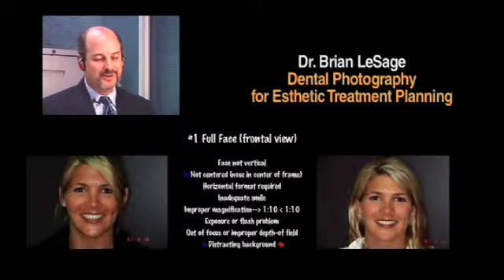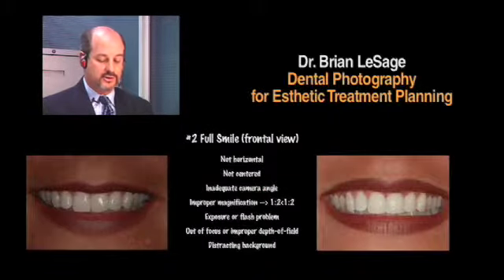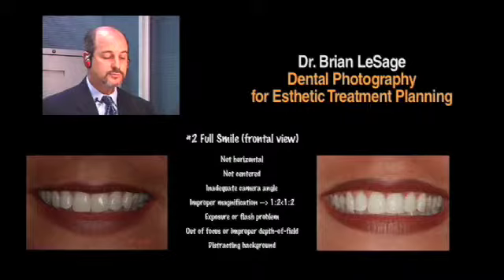So full face, no shoulders, top of the head, unless they got some buffoon hairdo, but basically the top of the head. Certainly want to see the chin closer to the bottom, nose in the center of the picture. That's your classic 1 to 10, okay? It's your classic 1 to 10 full face view.